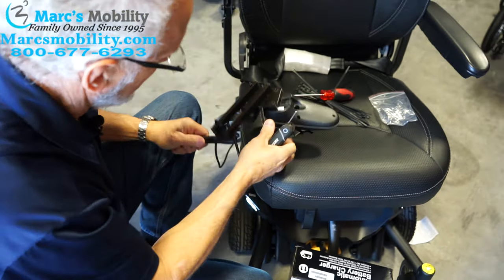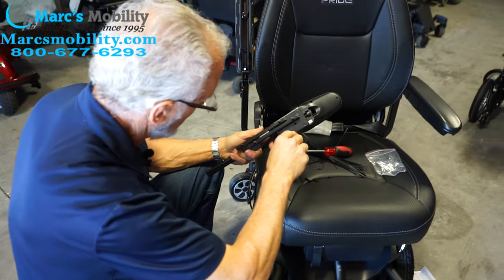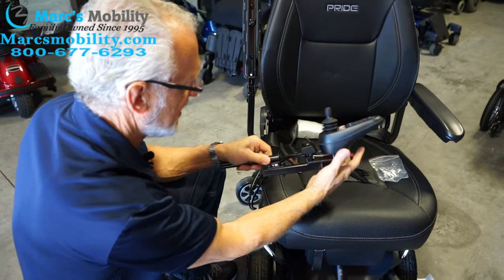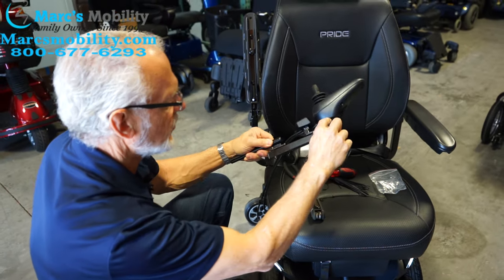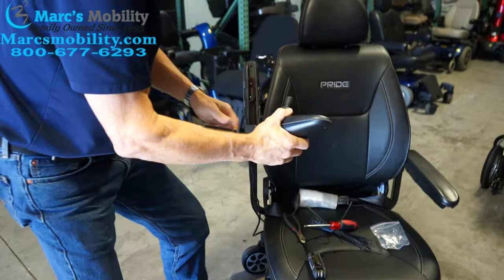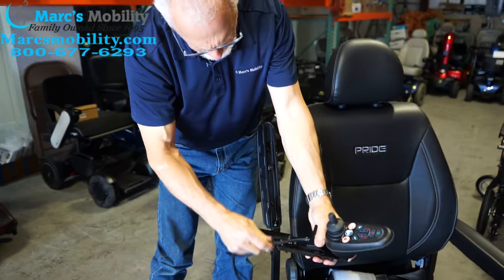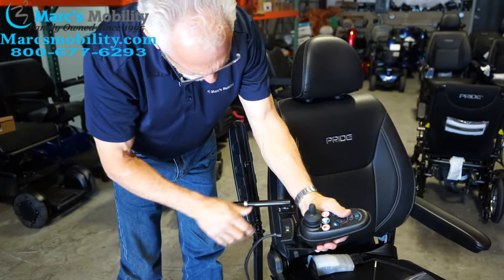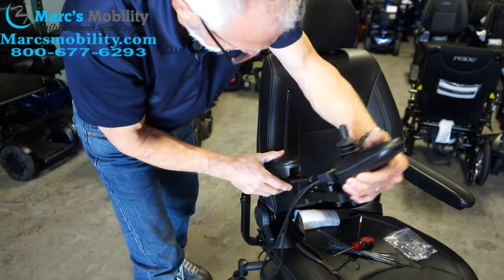You do have to have the spacers in there. You've got the two front screws for the joystick, the two small screws in the back for the switch box, and you have to have those two spacers in between to raise it up so it swings open. When you put it on the arm, make sure your cable is on the outside, not on the inside, because if it's on the inside it's going to drag. So make sure the cable is on the outside and put your arm in like this.